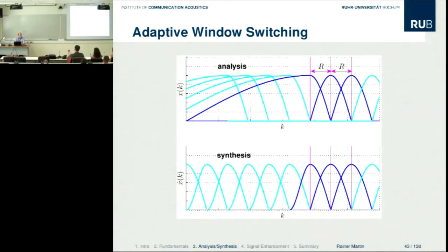You use the previous FFT, not necessarily recomputing everything. I mean, this should be very important. Yes, it is important, but I'm not sure it can be used with any type of window. I'm afraid to say probably not. That is actually a very interesting problem: with this type of windows, how the DFT can be adjusted. You probably need to compensate somehow.